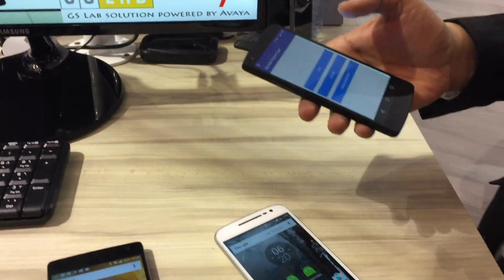A camera monitoring the patient can also capture the pain or the fall of the patient. Or the third use case: the wearable can detect the fall of the patient using the sensors built into it. So let's demo the first one.